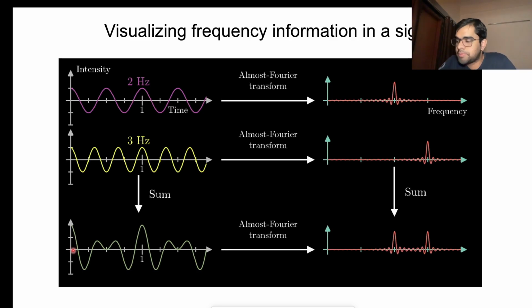I sense a fundamental doubt in Mr. R.K. Goyal's questions: the left side plots are plotted on the time axis and the right hand plots are plotted on the frequency axis. Correct. That's where the difference comes in. You should not read it as the peak coming later or earlier. It's in the frequency domain, so any peak can appear. If something appears at 0.5, then it will be sine of 0.5 t. Correct. That is just pi into 0.5.